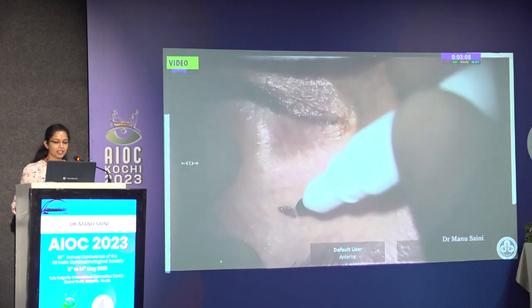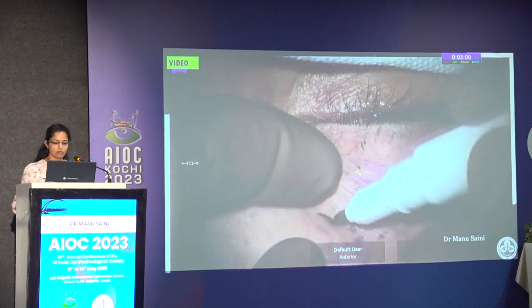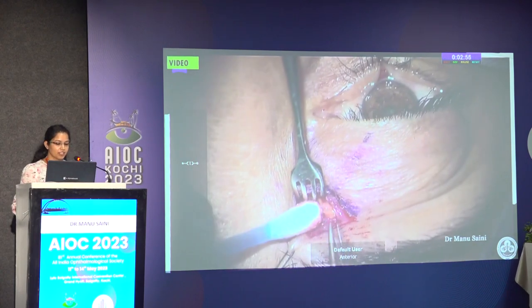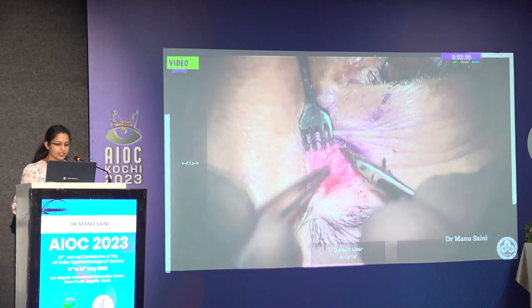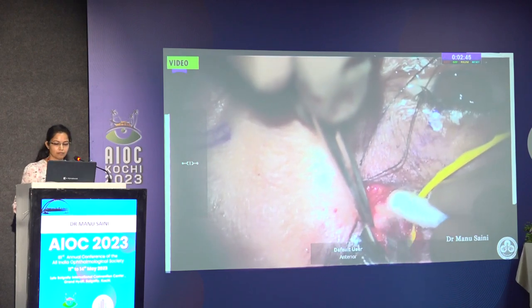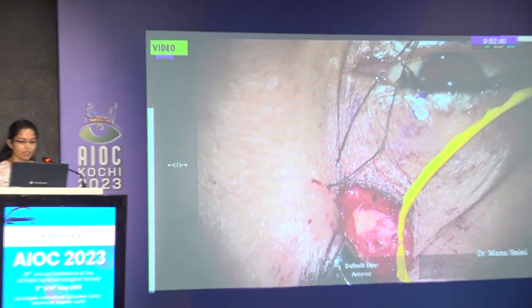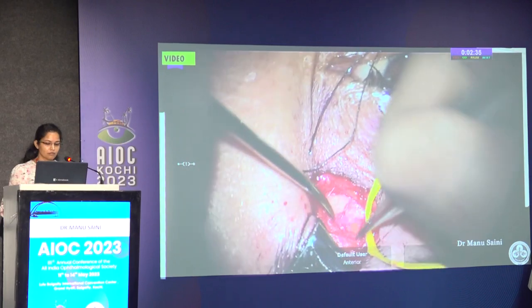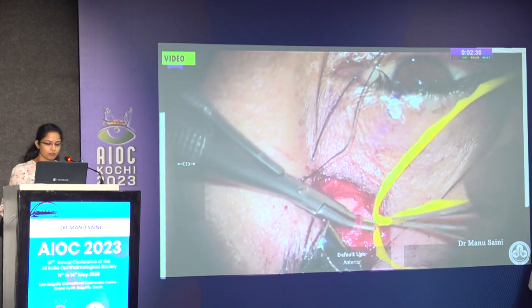Supra-brow incision was made on either side. Supratrochlear nerve was assessed on the non-affected side. Initially, superficial branches were identified. It was traced downward and medially at the periosteum to identify the confluence. Neurovascular bundle helped in confirmation of the supratrochlear nerve. Supratrochlear nerve was secured.